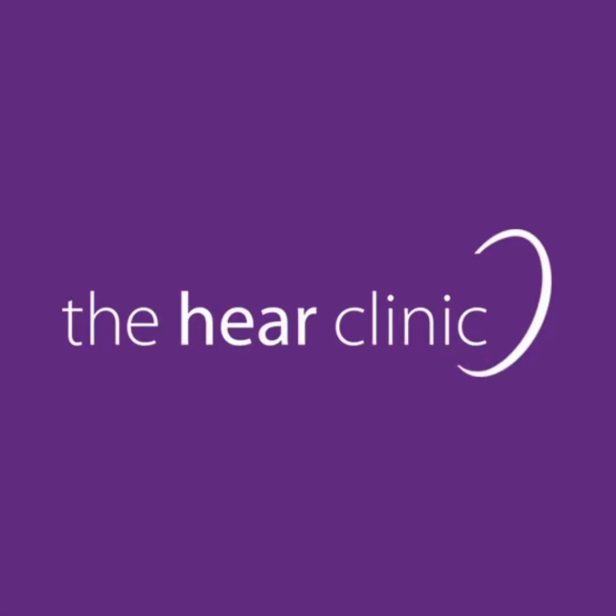Someone else commented that the suction wasn't very good in the last video because it took a long time to suction the oil. So I'm not sure how to respond. I've got the very best suction unit. It's a company called Eschmann, who are the Rolls-Royce of suction units. I'm using a standard Zollner suction probe, which is what we use for the ear. There's many different types of suction probes, a lot bigger, thicker ones, which would have too much suction, too noisy for the patient, could suck the eardrum away. Oil, of course, is a lot more viscous, it's a lot thicker. I'm actually tilting the patient's head to the side as well, so when I'm suctioning, I'm going against gravity.